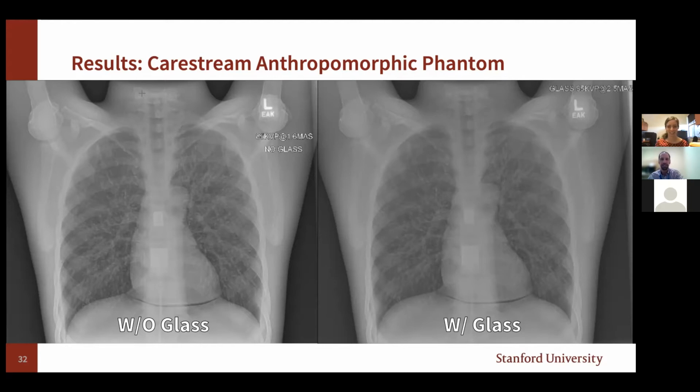And there's one other question here. What do you feel were the advantages that this new technique brought, and any disadvantages? Well, at the time, the advantage was really reduction of staff exposure to COVID, which we didn't really understand. These were frontline workers working with our COVID positive patients, as well as PPE conservation, which was another issue. Masks were under lock and key. So those were very real needs at the time.